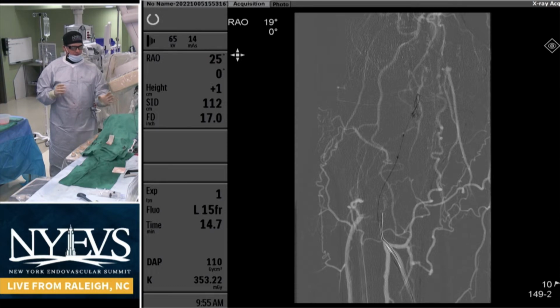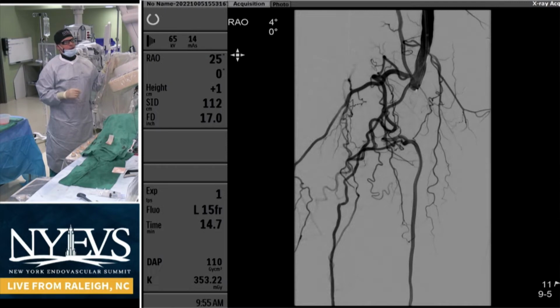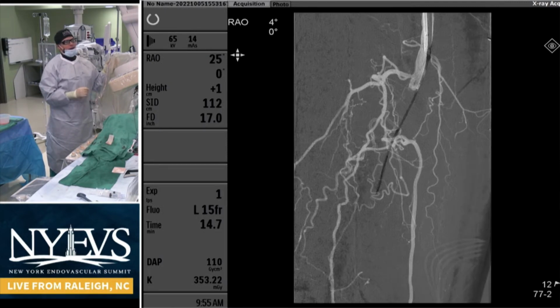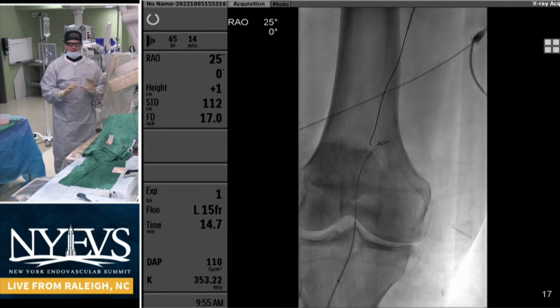Actually, I kept the V18 from below, and now I'm working from above, and I used a 30-gram Astato and went through a similar type of array. So I got up to a certain point from below. Now, as you can see, this is a NaviCross with the support of this wire, and now I was able to traverse a 30-gram Astato here. Now, I have no idea.